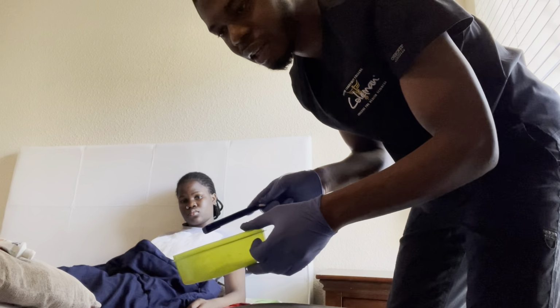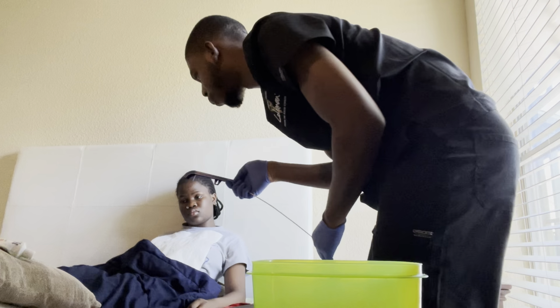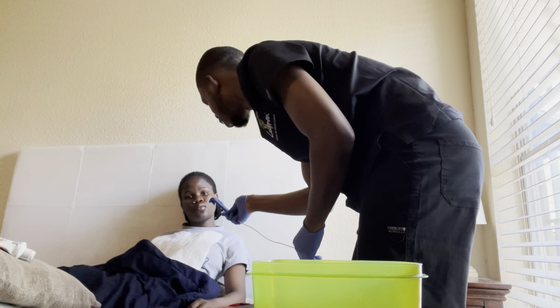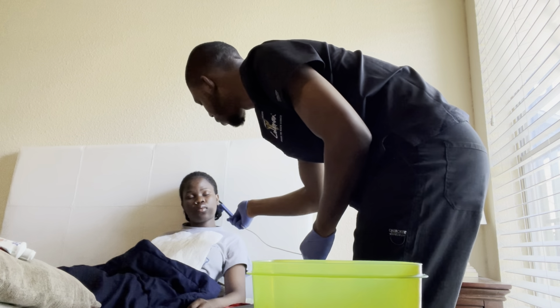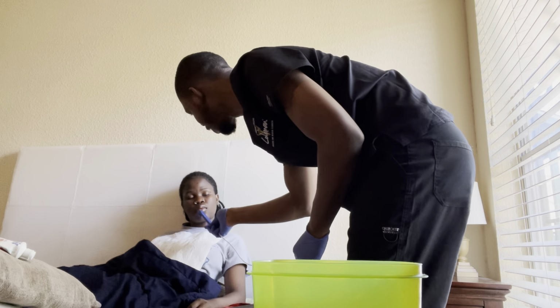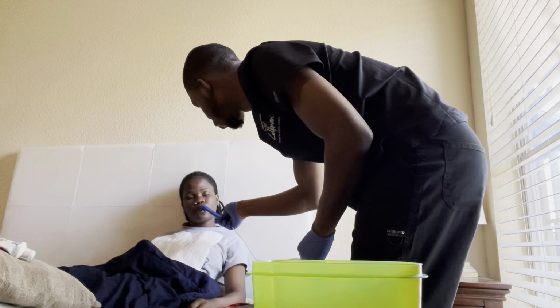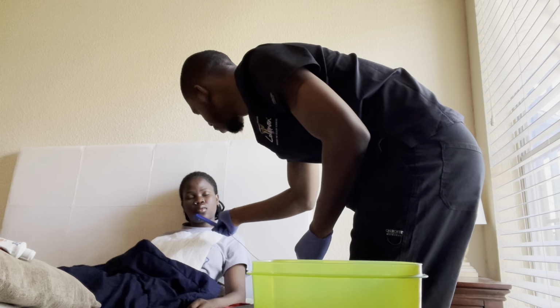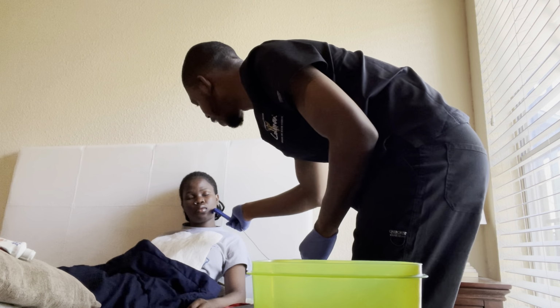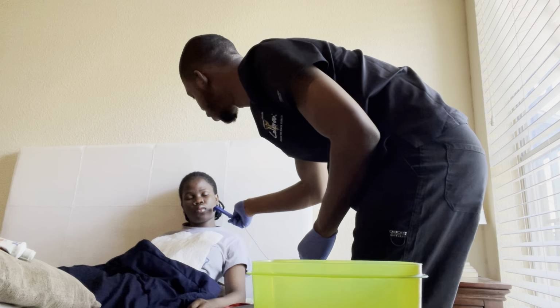Yeah, it's working perfectly. Now I will take the Yankauer catheter and I'll put it inside the patient's mouth. Okay, the catheter is in the patient's mouth. I will move the Yankauer catheter along the patient gum line towards the patient's pharynx. I am doing this in order to clear all the secretion in the patient's mouth.